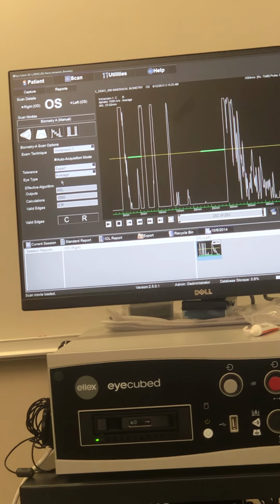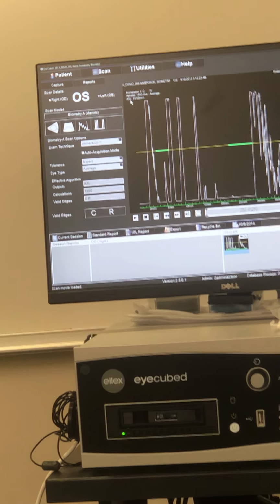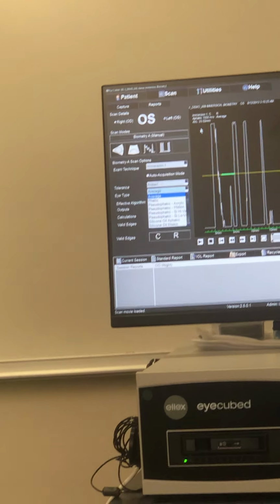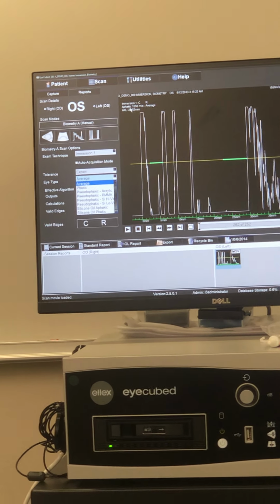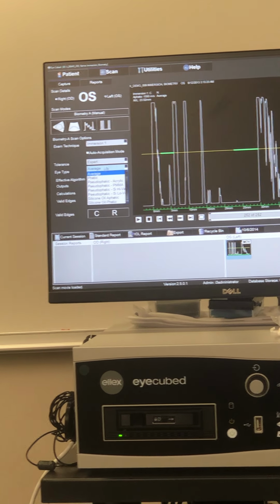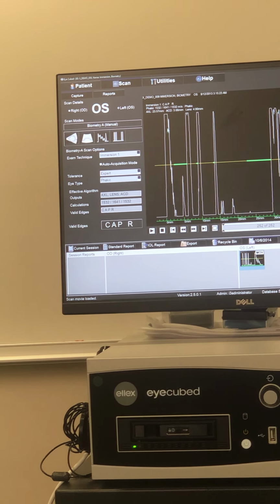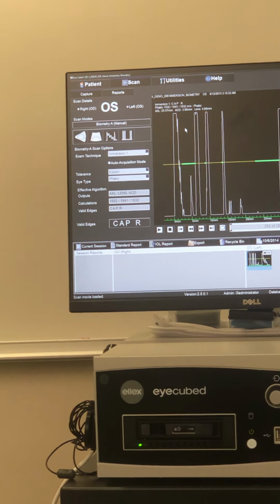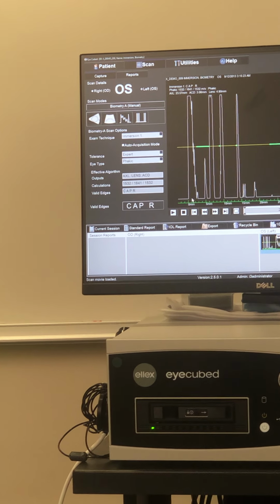And you can see as you change each one, the measurements change here. Average is just going to give you a straight axial length. It's not going to give you your AC, your lens, and so forth. Whereas if it's 23.52 and I change it to phakic, it's 23.57, so it's not that far off. You're just missing the AC and your lens.